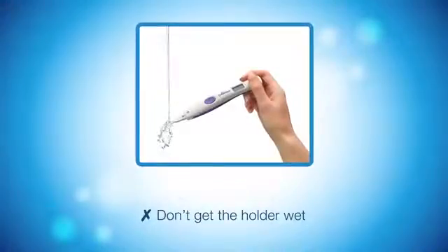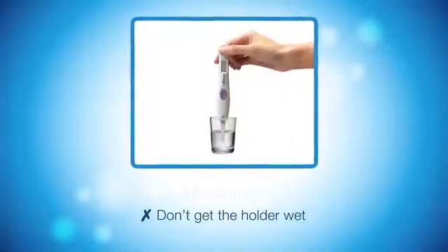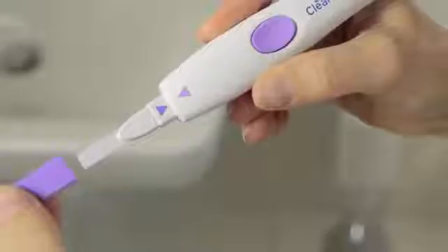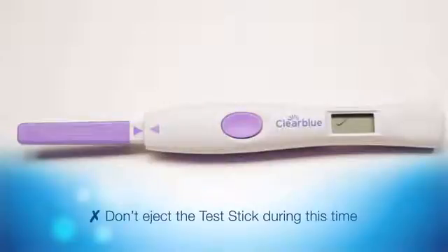Place the absorbent tip in your urine stream for three seconds, or dip it in a collected sample of your urine for 15 seconds. Throughout testing, never hold the test pointing upwards. After sampling, replace the cap and lay the test flat. The flashing test ready symbol shows the test is working.